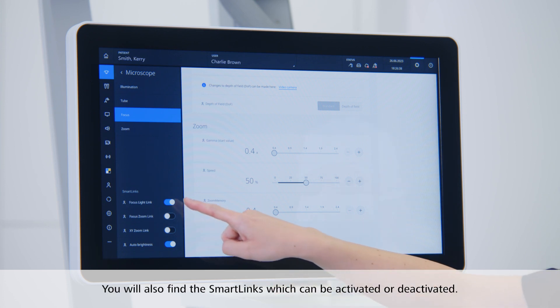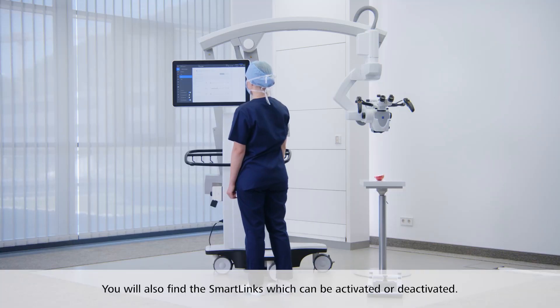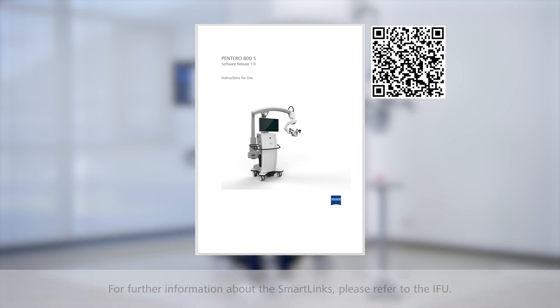In this menu, you will also find the smart links, which can be activated or deactivated here. For further information about the smart links, please refer to the instructions for use.